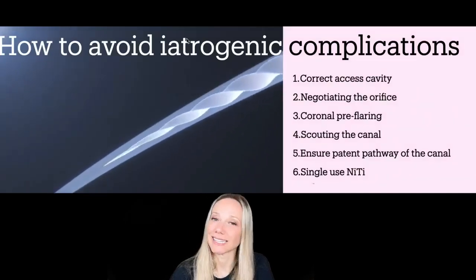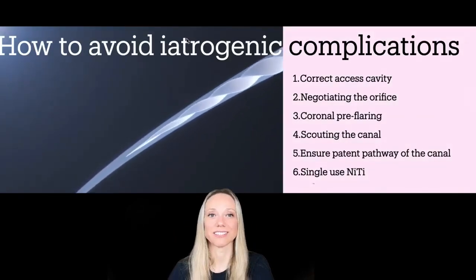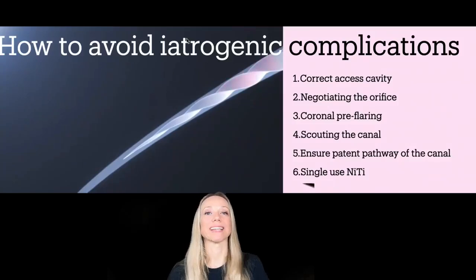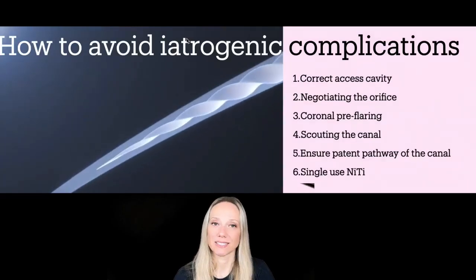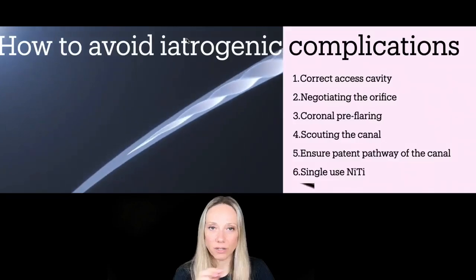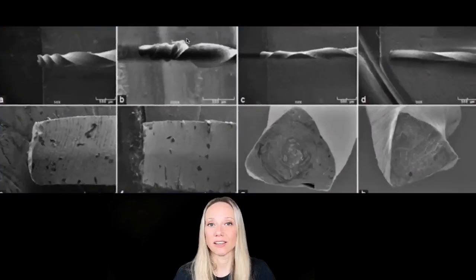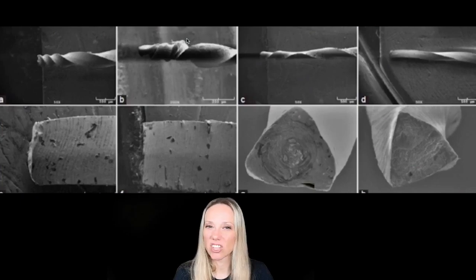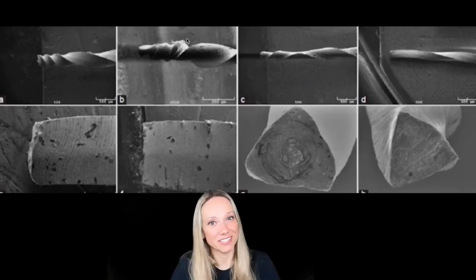And then, last but not least, and this is an advice that I will always give to the dentist, is try to use the nickel titanium files just one time, because we have to be extremely sincere. There are situations in which we use a file for a single time, we wash the file, we see that the file is deformed, we see that it's not perfect, we better discard it. Otherwise, we take the risk that the file is going to break. And so this is something that I don't want to happen.